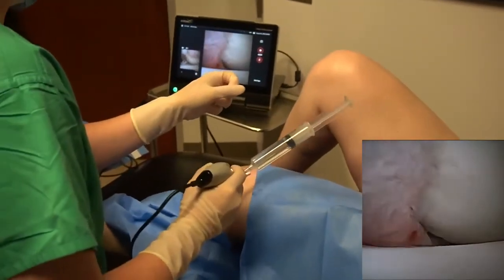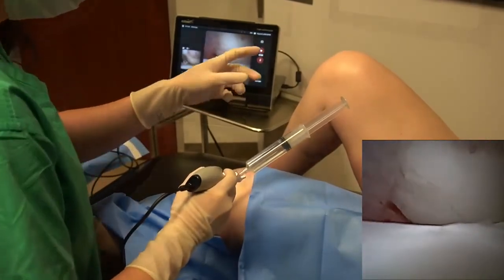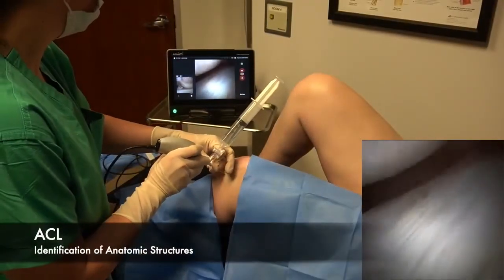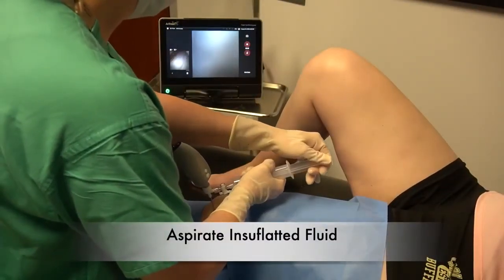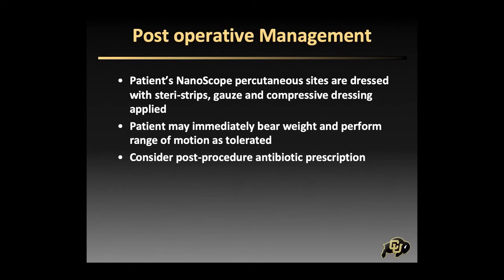After the nano arthroscopy is performed, aspirate as much fluid off the knee as possible. Steri-Strips are applied to the percutaneous portal sites, followed by gauze and an ACE wrap. The patient may ambulate immediately following, and consider giving post-procedure antibiotics.